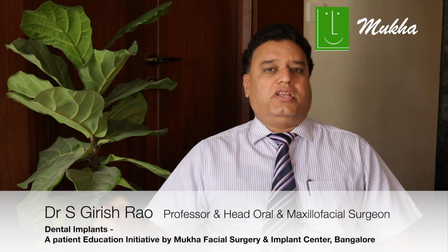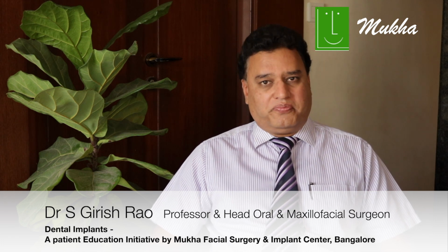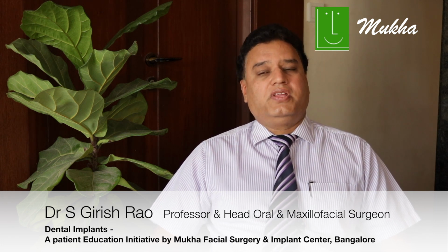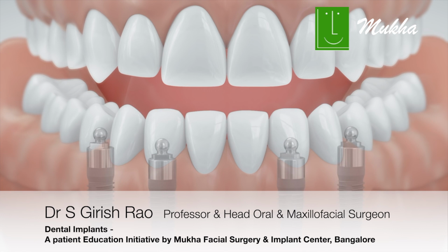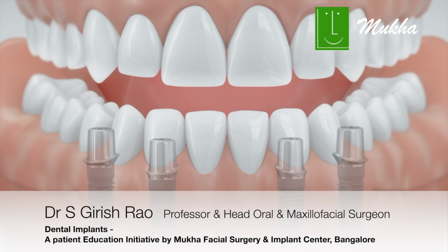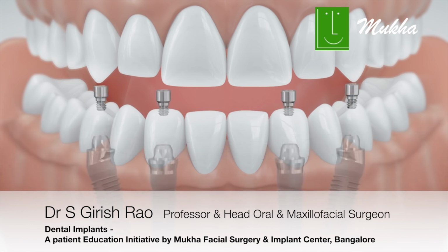Now with dental implants, we have completely revolutionized the way in which edentulation or missing teeth can be replaced today. When all your teeth are missing, we can put multiple dental implants into your jawbone. Taking the support of these implants, we construct a bridge which is fixed into the jawbone itself. So it replaces all the lost teeth, and it's the next best thing to your own natural teeth.